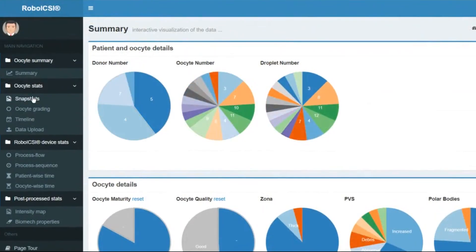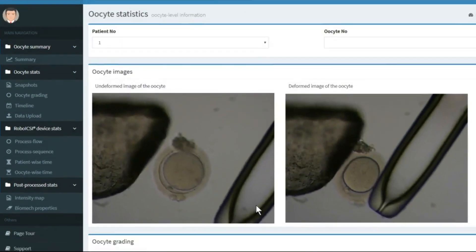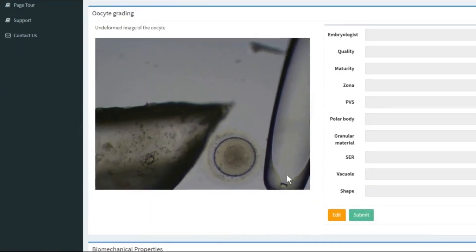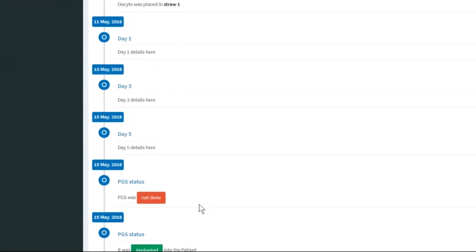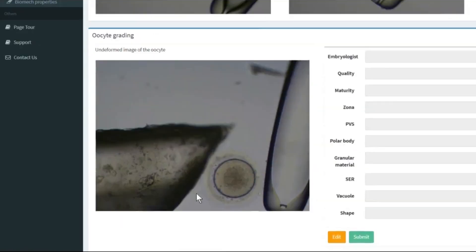Robo-ICSI seamlessly collects additional data like timestamps, user interactions, process steps, images and videos, and presents them coherently on a dashboard. Clinics can use this data to gather insights.